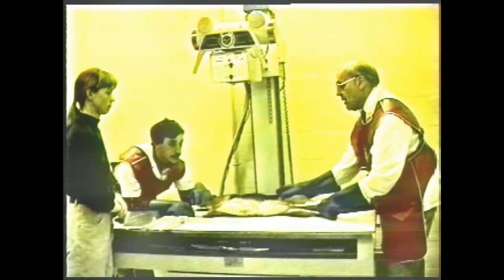In this particular case, though, with the thorax, it is often advisable to do the radiographs with the animal awake. There is less concern with collapse of the lung and giving an abnormal radiographic appearance if the animal is awake.